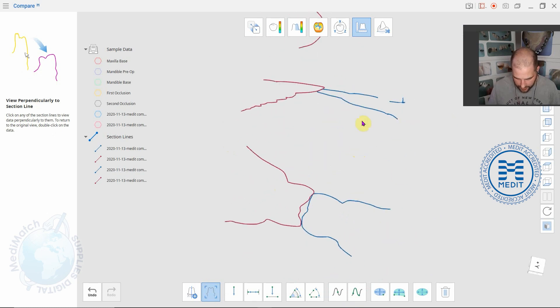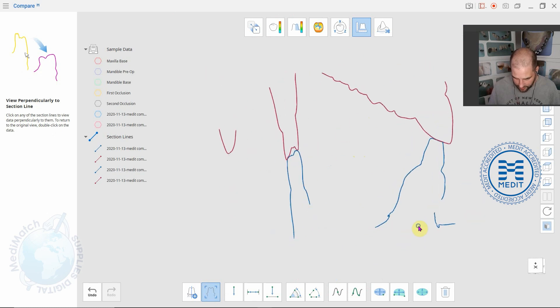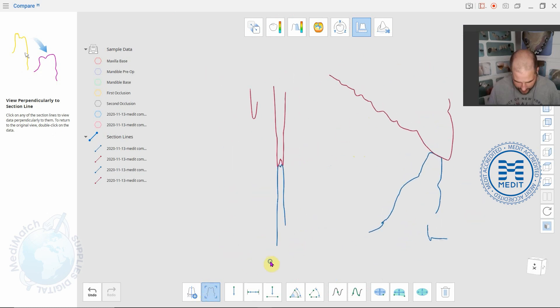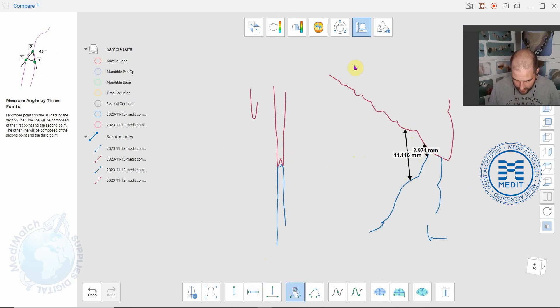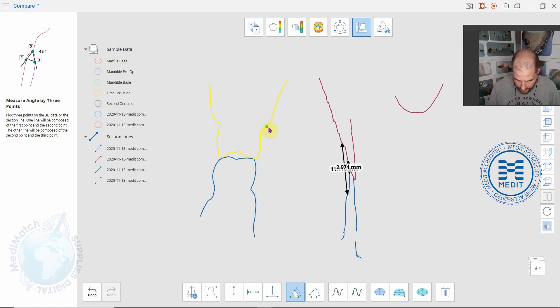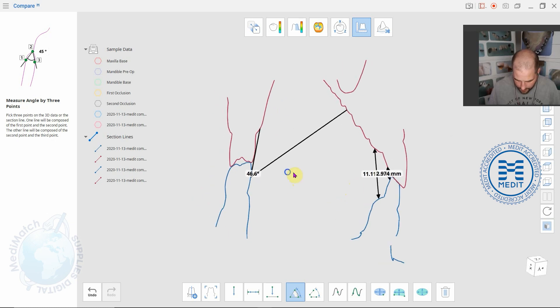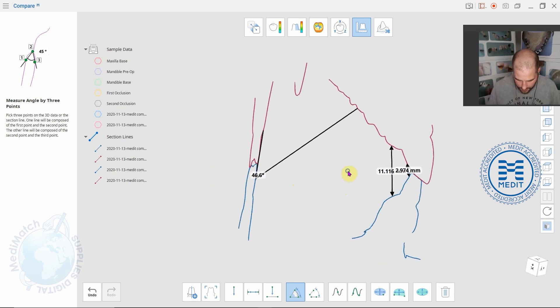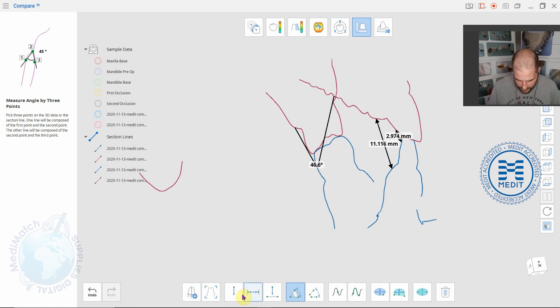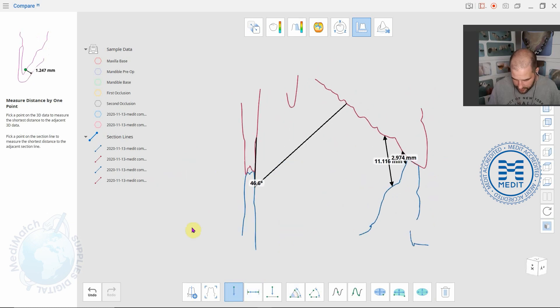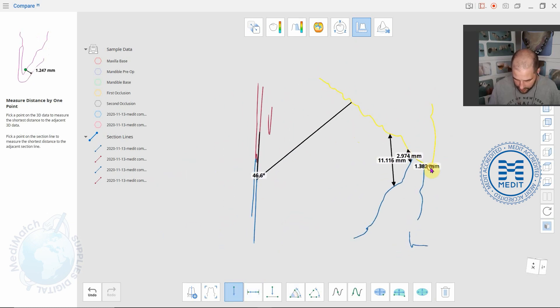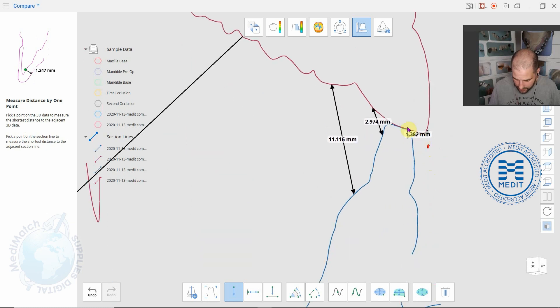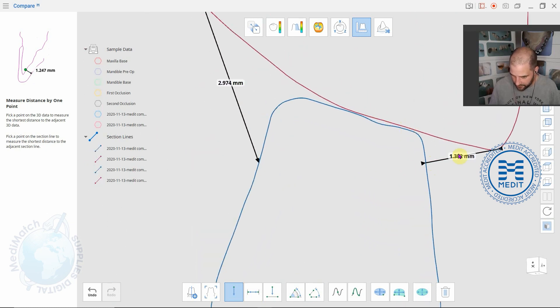Once you've got it lined up as you wish you can then, I think we've done this before in a previous video, you can use point to point measurement so you can do some distances if you wish. You can do angles if you're so inclined. This one's quite nice, this is measured to the closest point so you only have to select one point and it will measure to the closest opposing point, which for that point there it was this here.